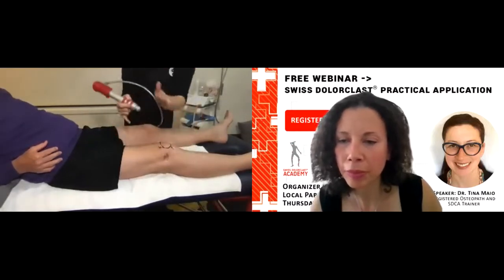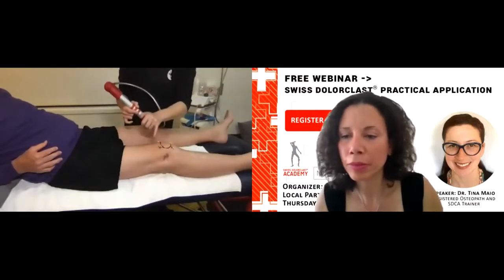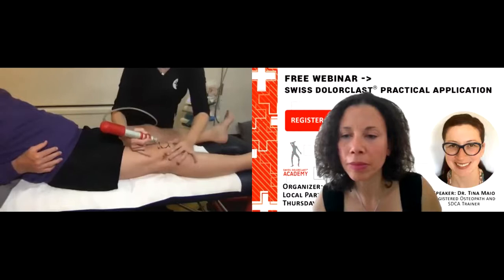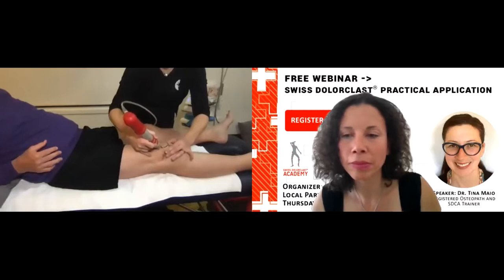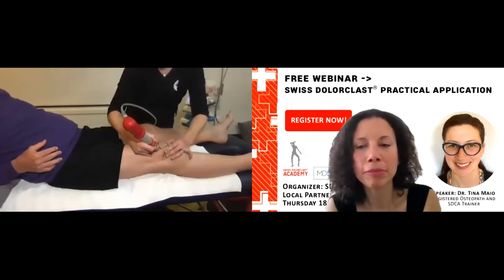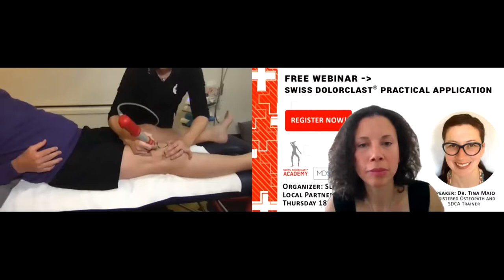So if we want a patella to move inferiorly, the top poles can actually help lift it and then help push it down. Okay, so I'm actually going to hold, and if I can, try to lift it a little bit. You okay? Breathing in and out there. Good. So I'm directing my shockwave to go underneath that border of the patella. I'm just moving around there.